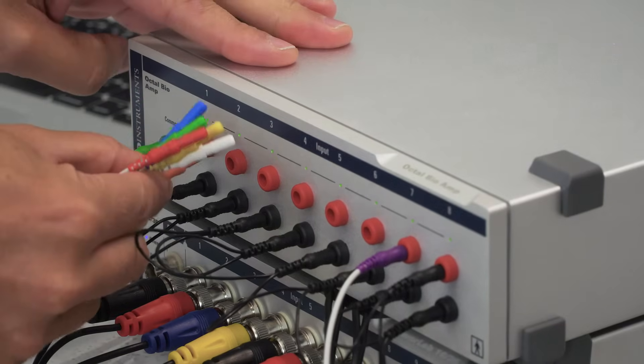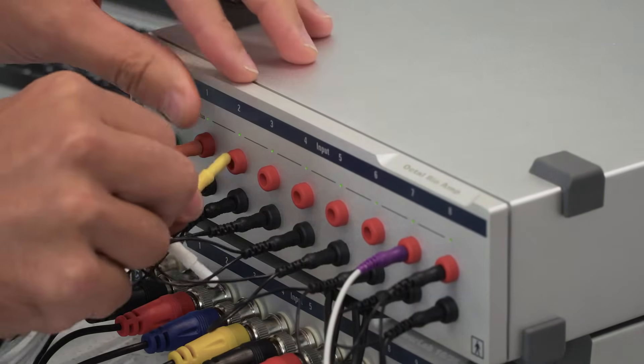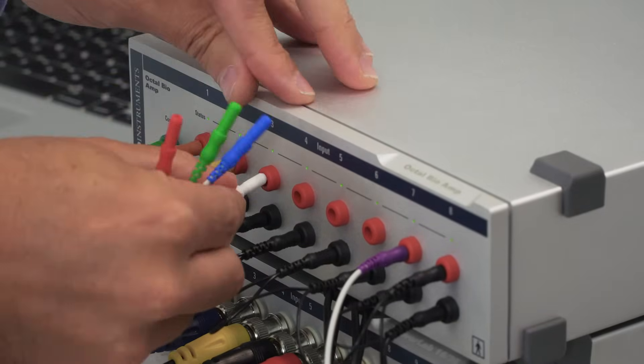Then we can take each of these wires and run them into the octal bioamp into channels 1 through 6.